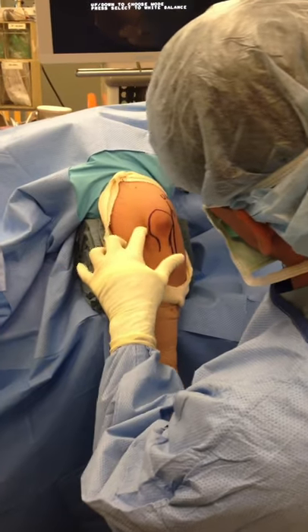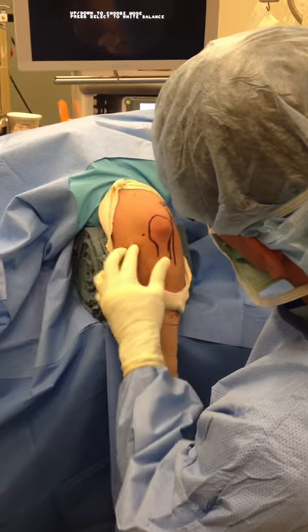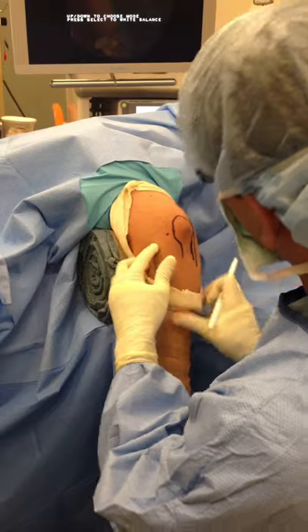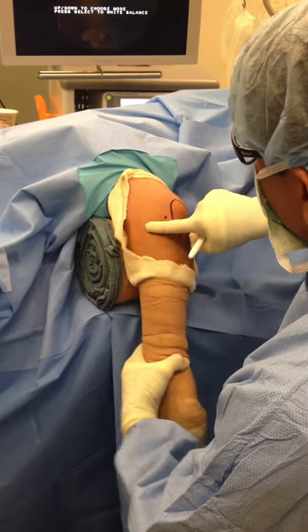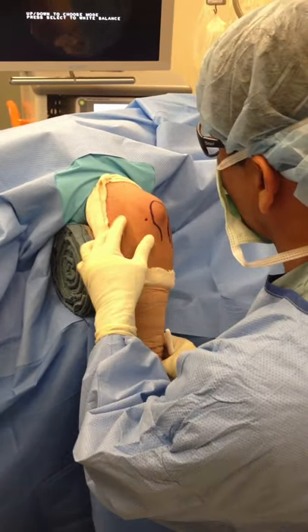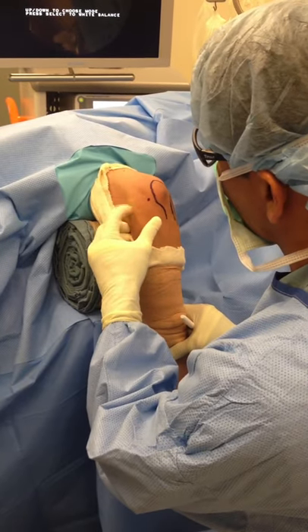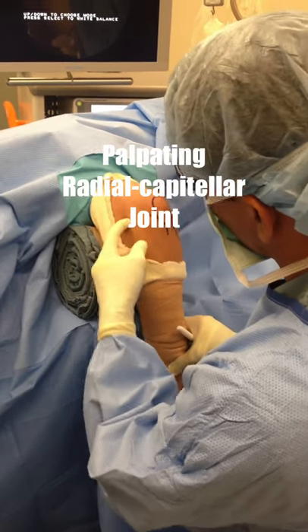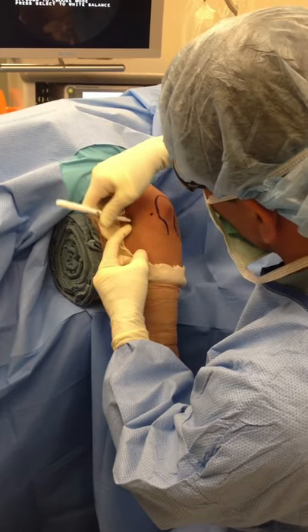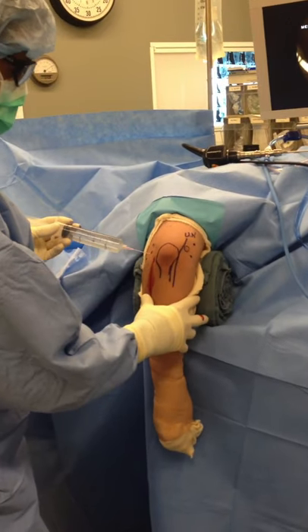and then the soft spot, and the radiocapitellar joint. First, we're going to insufflate the joint with some saline.